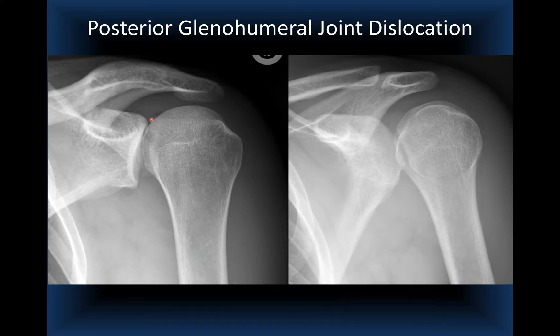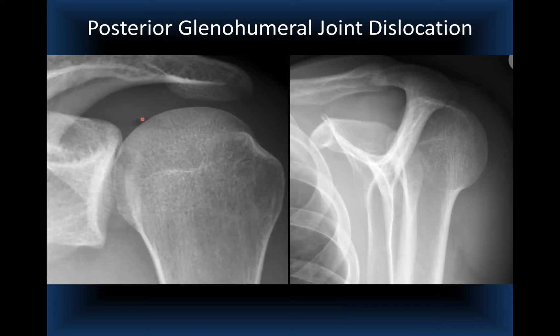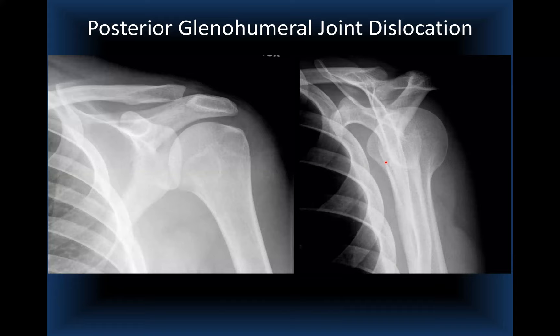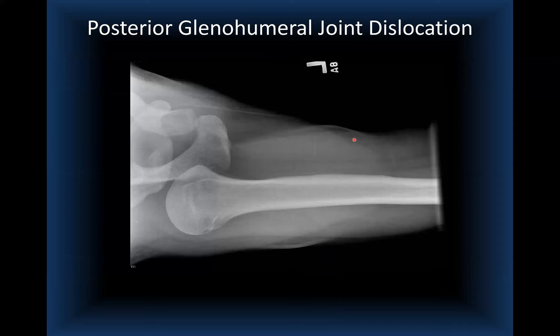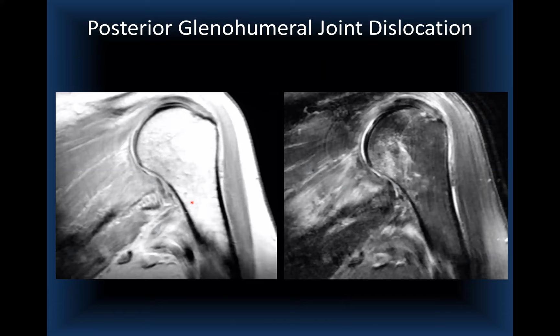On the magnified view and the transscapular Y view, the humeral head is displaced posteriorly with respect to the center of the scapular Y. On the axillary view, by gravity alone, you can clearly see the humeral head fallen off the glenoid posteriorly. On MRI in the acute posterior dislocation setting, the anatomy of the posterior cuff — infraspinatus and teres minor — is visible, and the humeral head is displaced posteriorly.